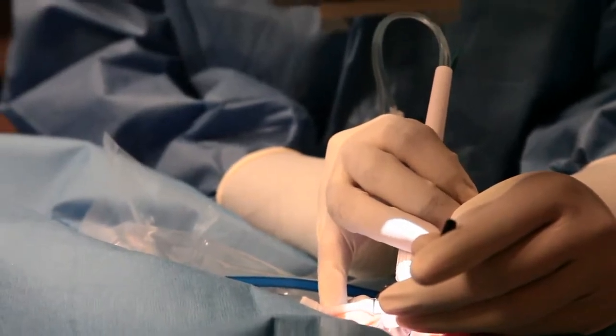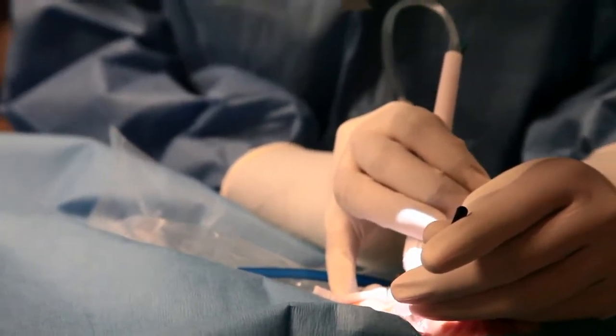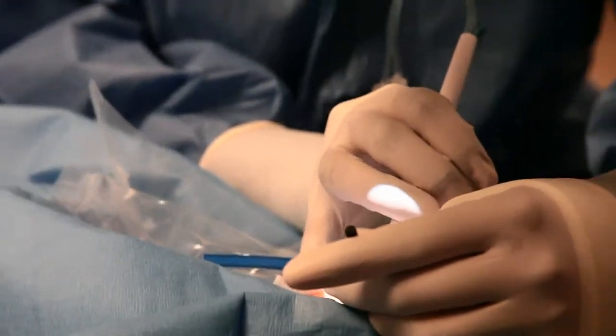And I think that's where doing this for so many years comes in. When I first started doing trabectome, I still find those patients challenging, but it was really challenging early on with patients who had open but slightly narrowish angles to really get good visibility during the surgery. People really have to know their gonio and know the angle, even when you're going in, and know what the landmarks are, because what I do like about it is that it is a fairly simple procedure.